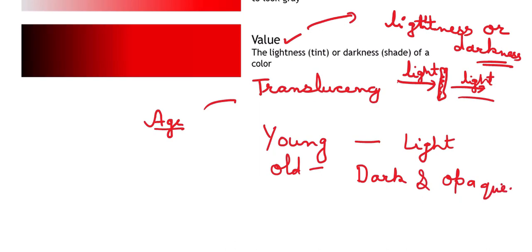Other affecting things could be habits, complexion, eyes, and hair color. All contribute to the overall appearance of the tooth and should be considered while selecting tooth color for the most natural outcome. Now, what are the factors that affect the tooth appearance and the color selection? First of all, what is the aging effect on tooth appearance?